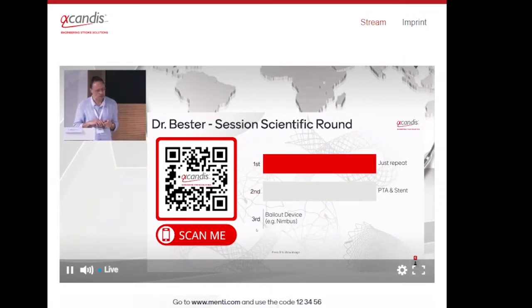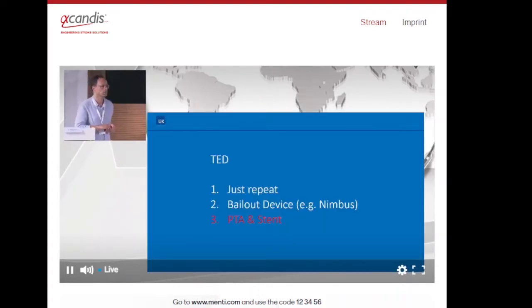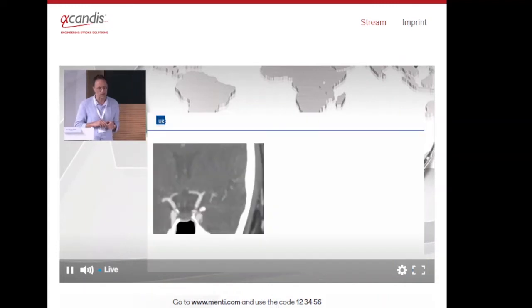Okay, very interesting. So in all the questions I put in, I believe there's no wrong or right. I just can show what we did actually. Now, the longer we wait, it's maybe like with an intervention, things change. But now, like PTA and stent, I believe repeating is something interesting. Actually, I think we could continue with the slides, please. What we did, not saying that this is right and repeating would be something that is wrong, we went for PTA and stent at that moment.